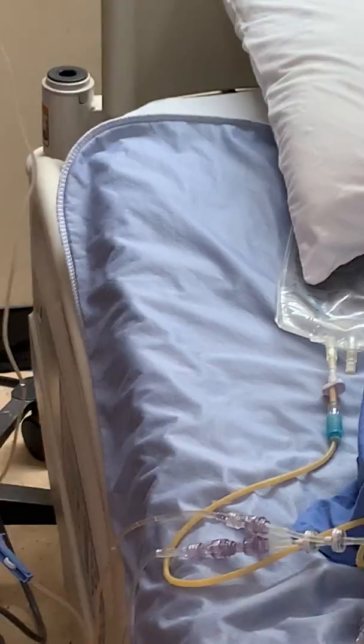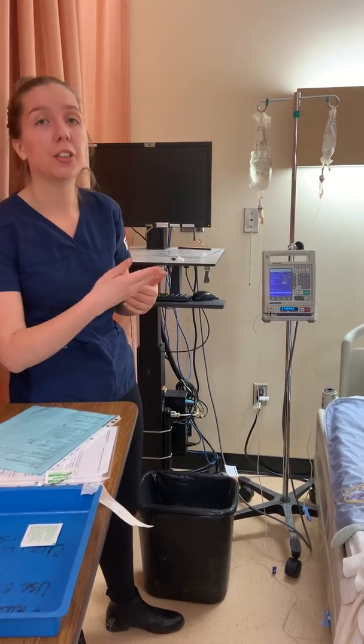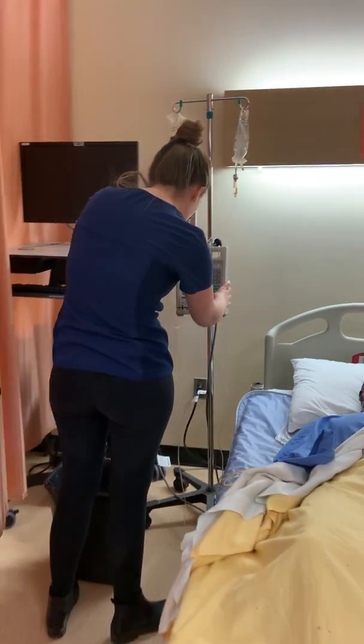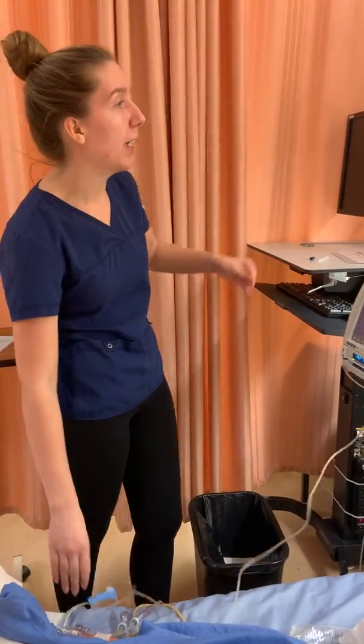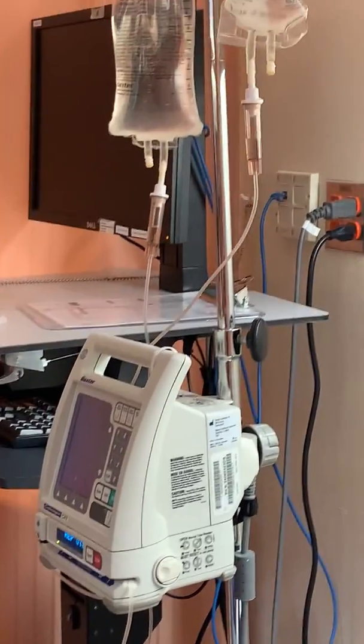Okay, at this point I would have a second nurse come in and do an independent double check. They've done so, they've approved that I have set it up correctly. I've connected my patient, therefore I can start the infusion. So I'm going to do confirm and start. I'm going to make sure that any clamps are open. And I can now see 3 drips, which indicates that it is working. So I've set up my patient correctly.